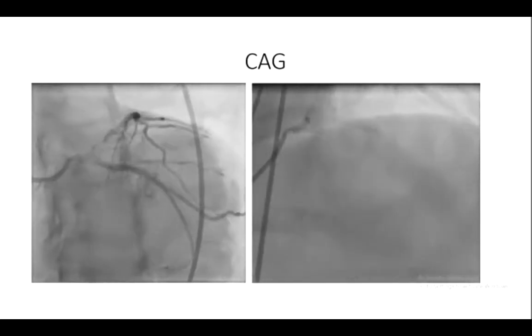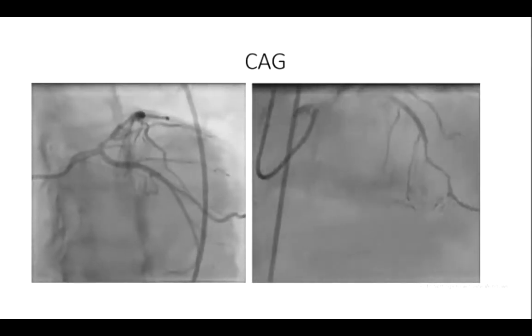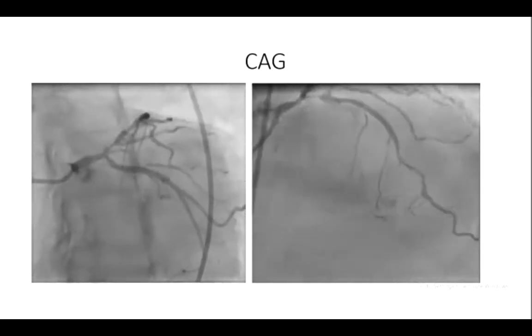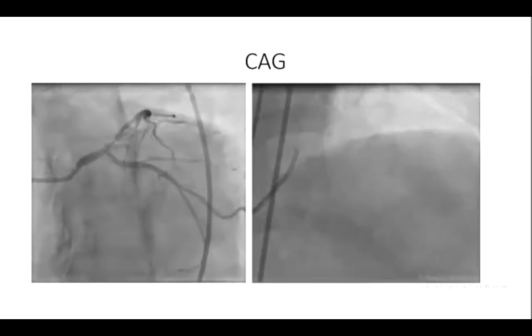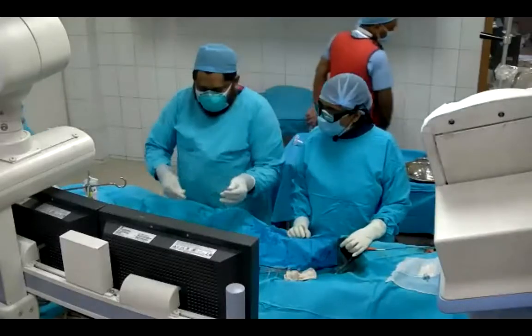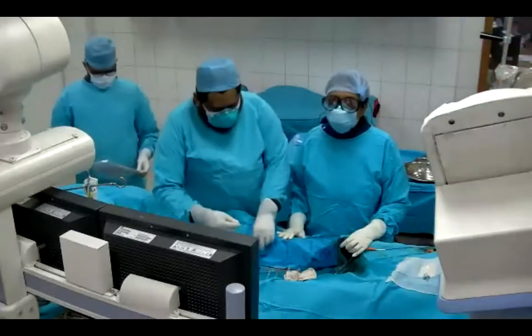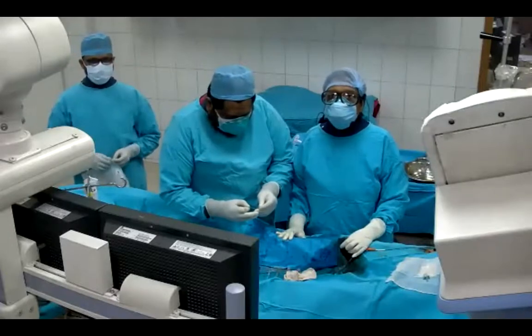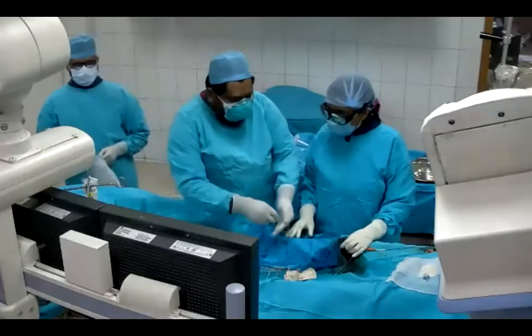We want to give the patient the best possible result. As you rightly say, he has CKD. And that's why, since he had severe triple vessel disease, we also staged the procedure for him. And we feel that the best option for him would be a double stent strategy. And with that, we've already pre-dilated the LCX. We will be committed to a double stent strategy, but I totally appreciate your thoughts. And it is indeed a good option to try with provisional stenting and then go for crossover.